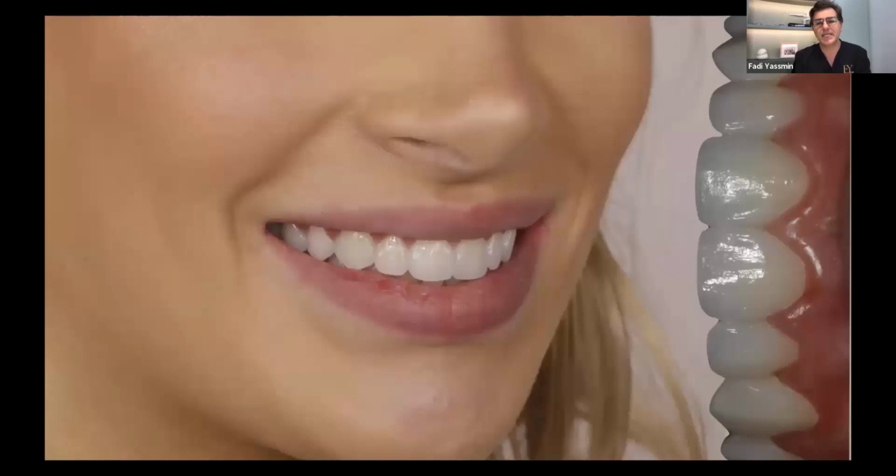In this particular case, it's very natural, and a lot of patients want natural-looking restorations. As a result, you're able to achieve this quite easily if you follow the protocols. And you can see in this case, all these textures haven't been done with the burr. They're picked up in the actual prep file, which is quite important.